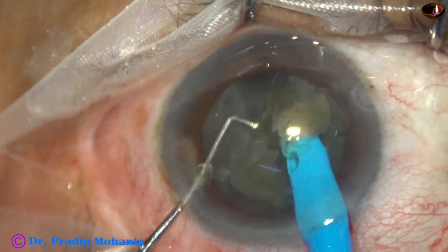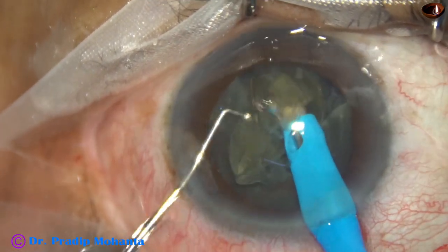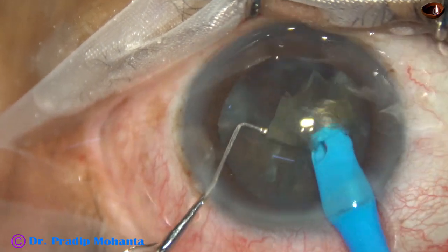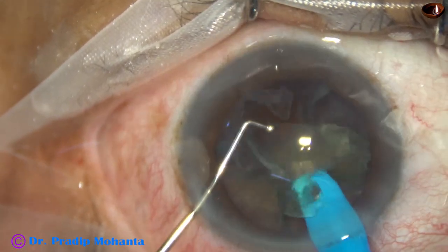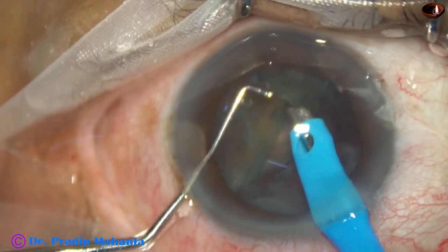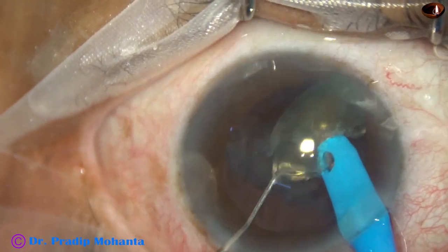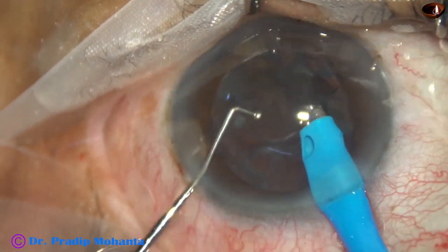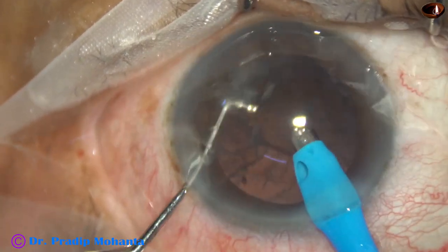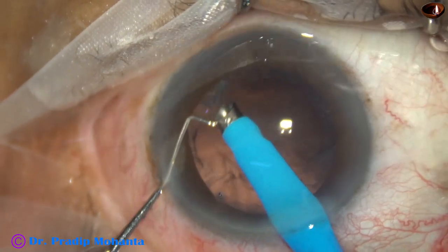The pre-chopper solves these problems. You can make a 5 mm rhexis, divide the nucleus within the bag, and pick up each nuclear piece one by one and emulsify. The nucleus has already been divided into four fragments — the pieces are being picked up and emulsified. Ultrasonic energy used is very minimal; in this case, only 40% ultrasonic energy was used. In a very short time, we have managed the nucleus.